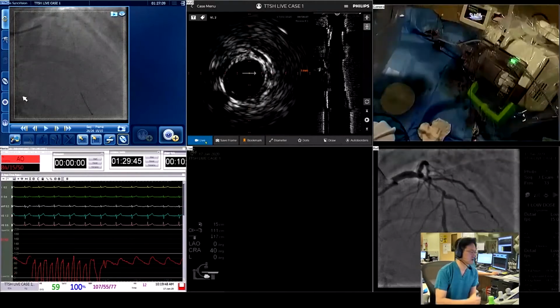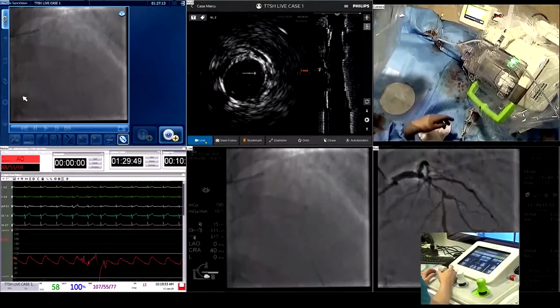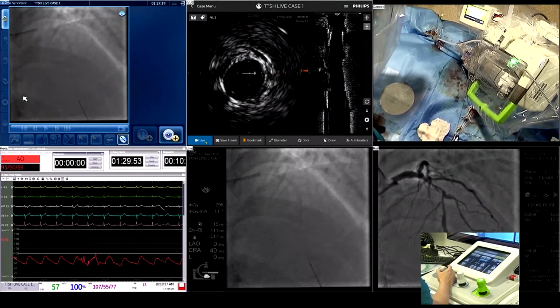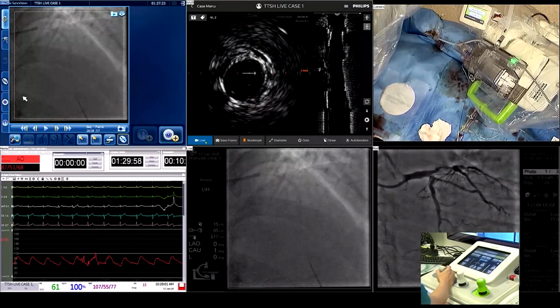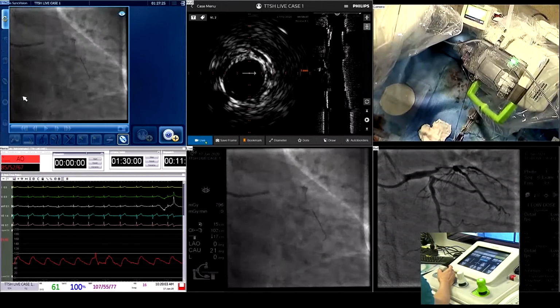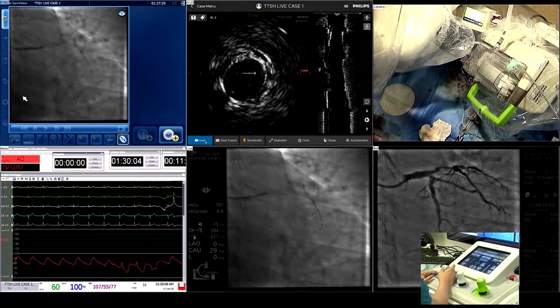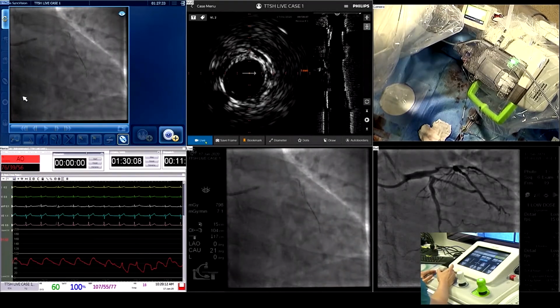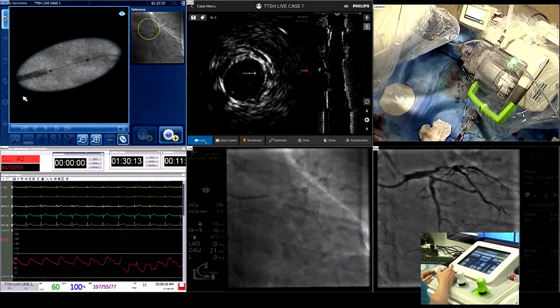Okay, let's carry on. Kai Wan, maybe I can ask you, apart from the setup, the machine, the robotic arm, what is the additional cost for the patient by using this machine? I think only the cassette is additional, right? Yes. So in Tan Tock Seng, at the moment, we are just charging the patient per cassette.